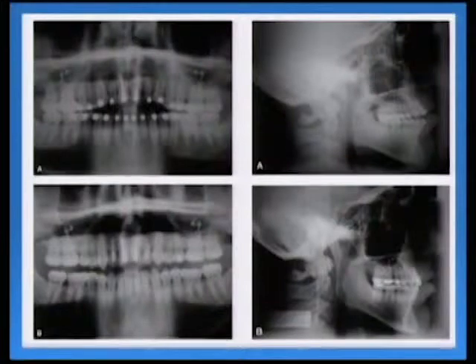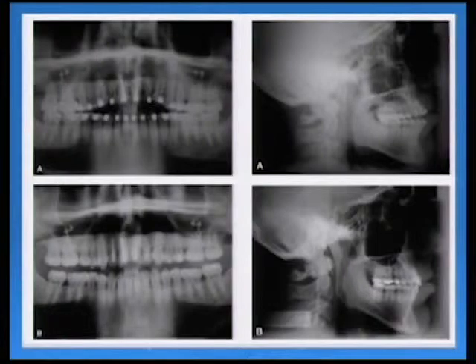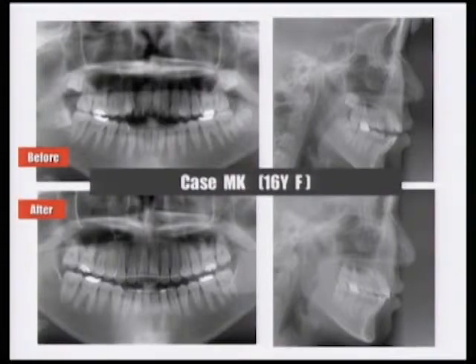These are the photos in Dr. Sherwood's paper, treated using zygomatic mini plates. So I changed this setting, and these are similar photos of my patient, which I'm going to show you today, treated with one mid-palatal mini screw and extracting third molars only. So I'm going to show you this case later.